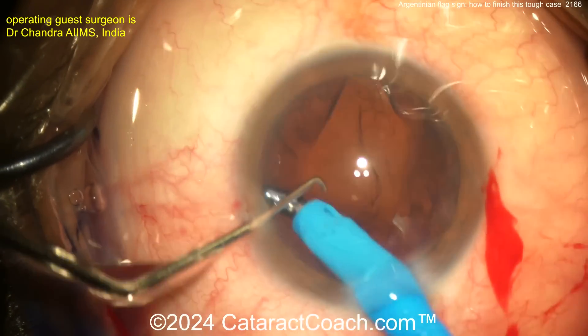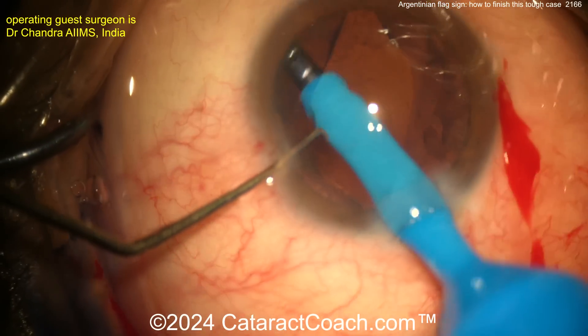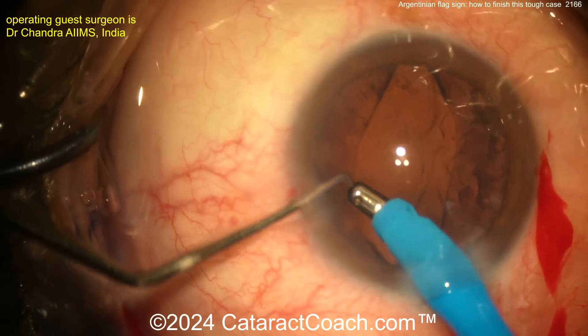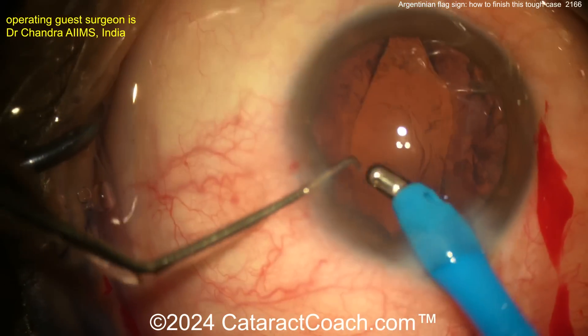On a case like this, honestly, I'd be tempted to put the IOL in the bag first and then try to clean up some of that lens material, since I already have the IOL in the bag. But you can certainly do it this way too.